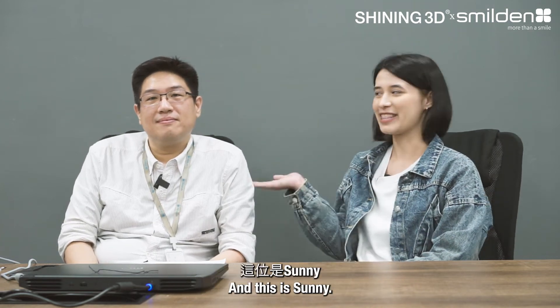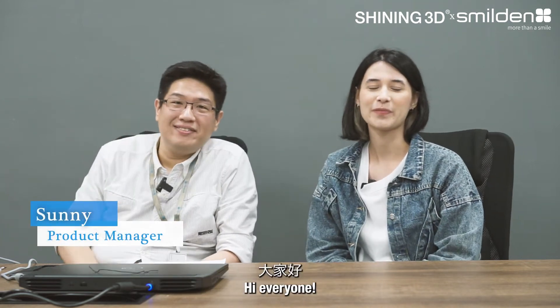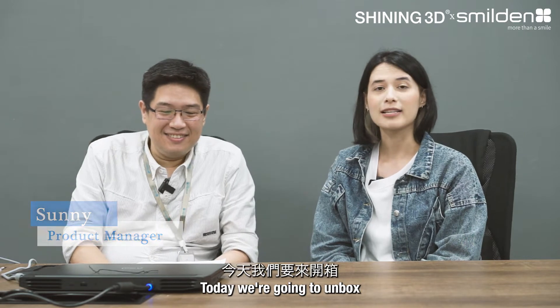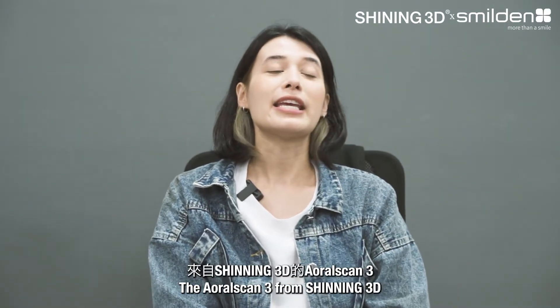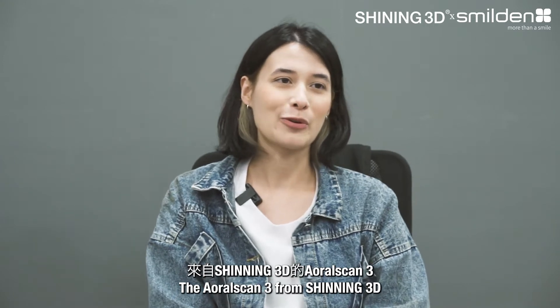Hello everyone, my name is Bonnie and this is Sunny. Hi everyone. Today we're going to unbox the latest intraoral scanner on the market, the AoralScan3 from Shining3D.